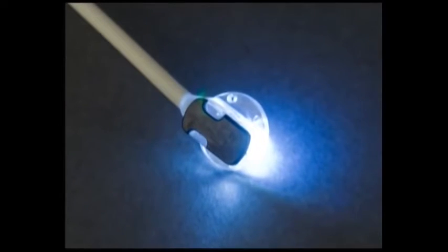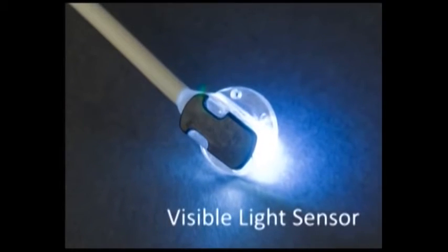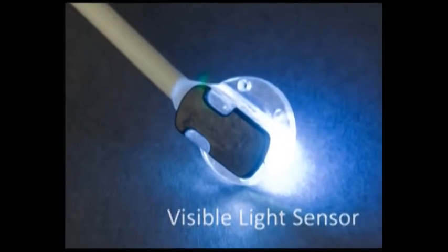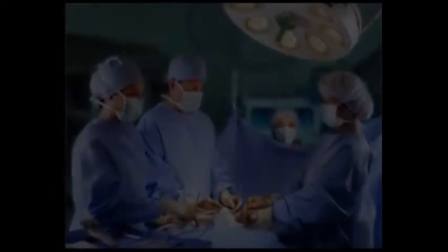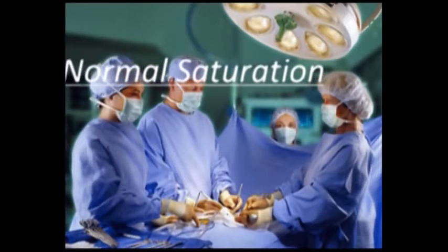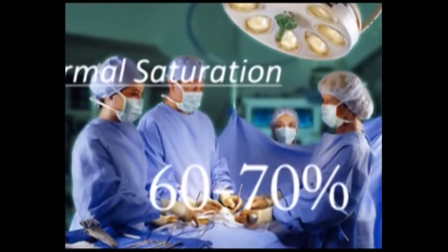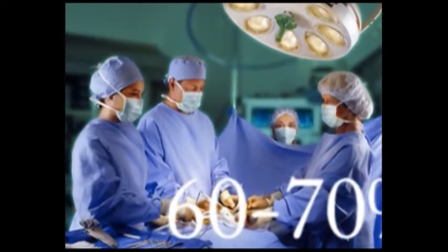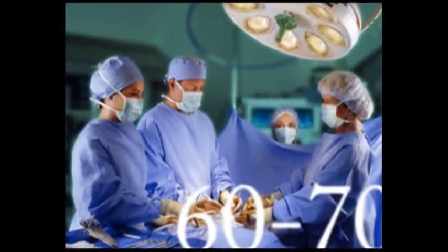This is a difference you can see. T-Stat's broadband VLS sensors glow white, not red, to provide a high accuracy without calibration or adjustment. Healthy tissue typically has a tissue saturation value between 60 and 70%. The normal values for your patients may vary depending upon the type of tissue you are monitoring and the patient's medical condition.